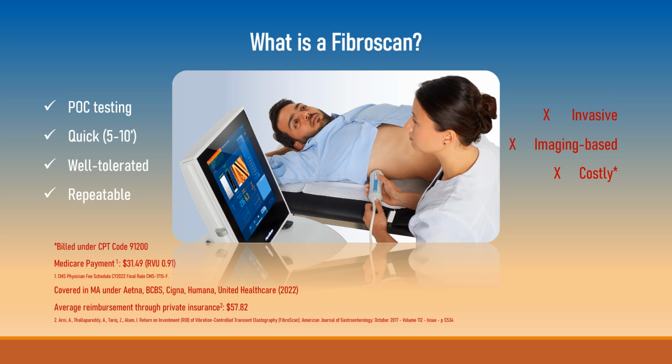So this is non-invasive and well-tolerated point-of-care testing that quickly produces results and can be repeated as clinically indicated. It does not visualize the liver parenchyma. Fibroscan is not imaging. Its cost is higher than a FIB4, but much lower than other modalities, and the cost has steadily decreased since it was first made available.